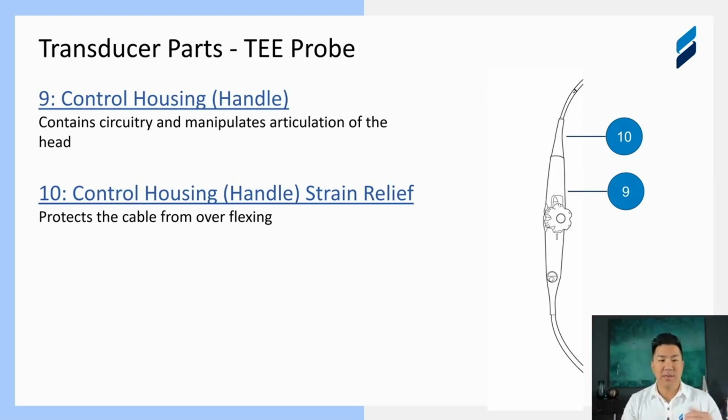Corrosion's tough because you can clean it at its early stages and there's no harm, no foul, no damage. But if it sits there for a while, it literally eats away at the metals and starts pitting it and starts, really, eroding at the material to where there's just nothing else there. So it's something to look out for.